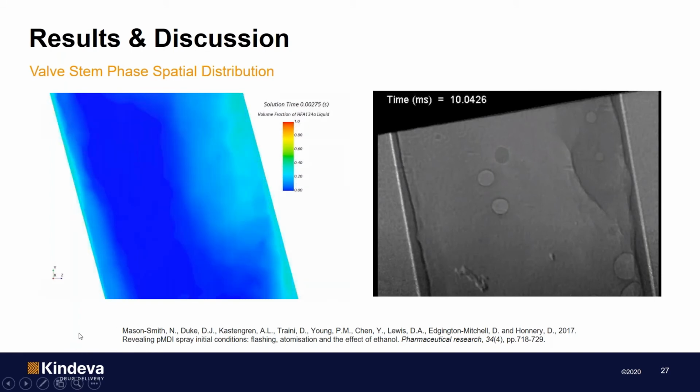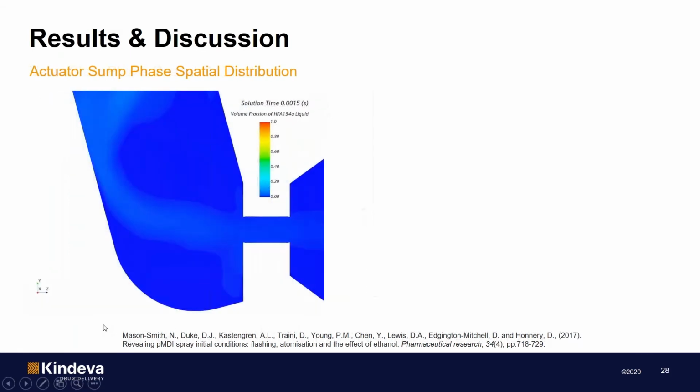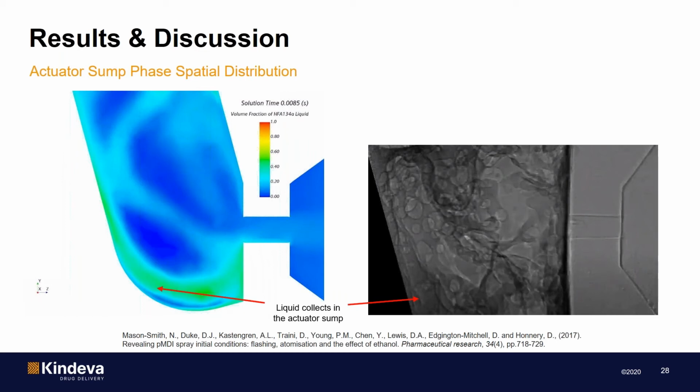Now, the next set of results is basically the flow in the actuator sump. Again, as we can see, the model predicts how the liquid drains down the wall of the expansion chamber and collects in the actuator sump. And you can see such phase distribution has also been observed in the phase contrast images as well.